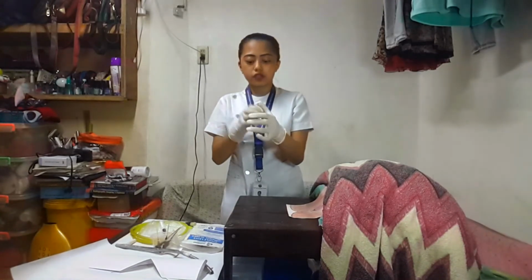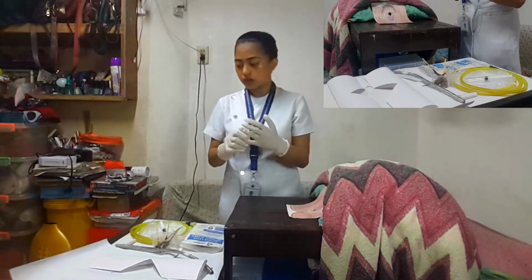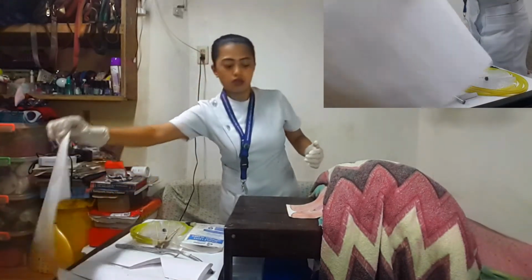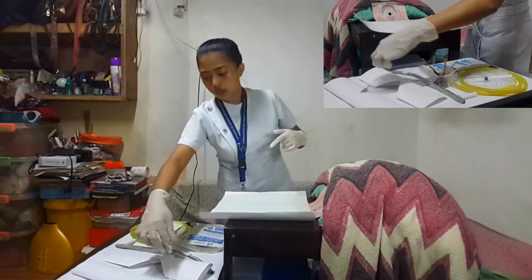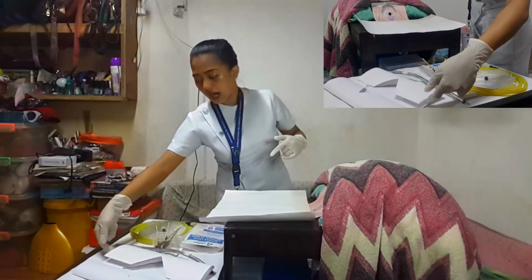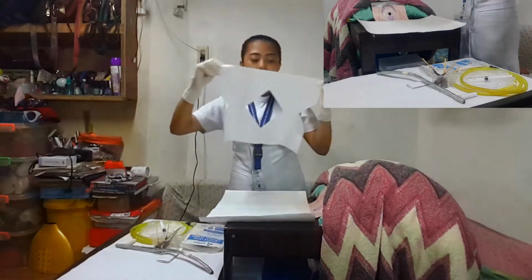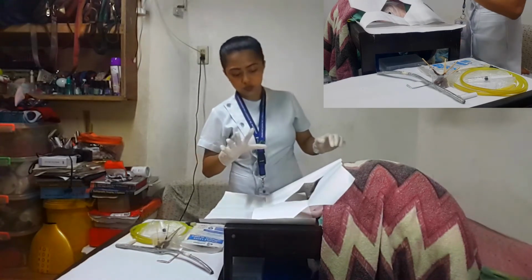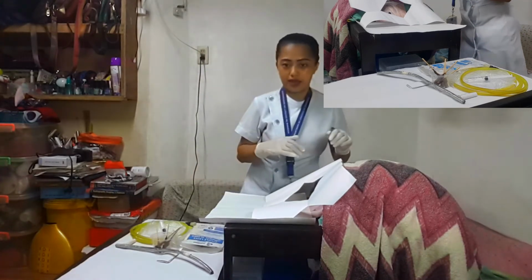Alright, so after we wear the clean gloves, we'll now place the waterproof drape under the buttocks of the patient, and make sure that we will not contaminate the center of the drape, because this is where it exposes the labia.